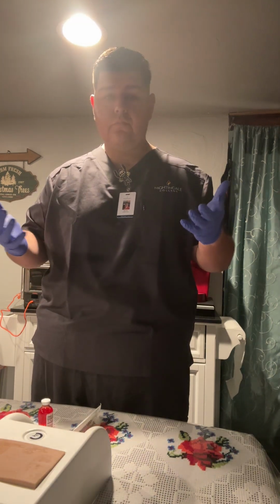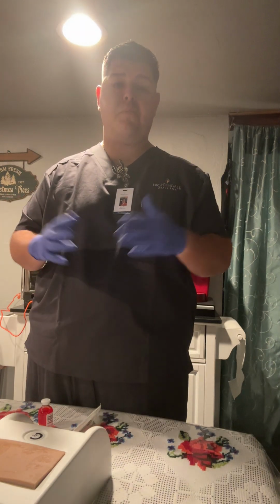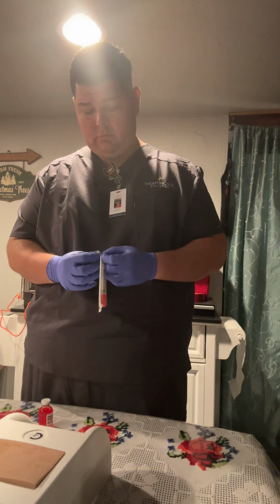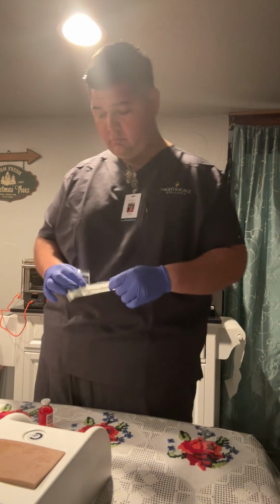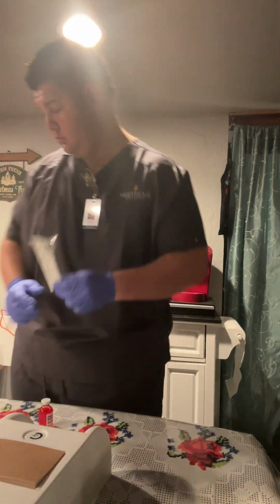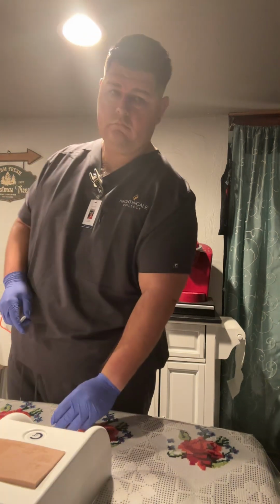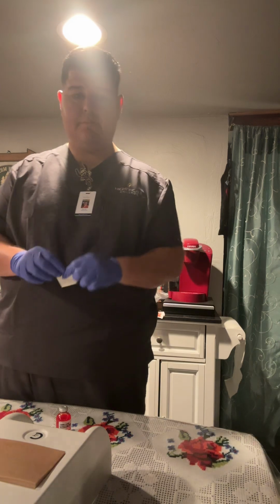So, first and foremost, I'll start with the preparation, and I will remove everything from the packaging and dispose of it. I want to clean the top of my vial.